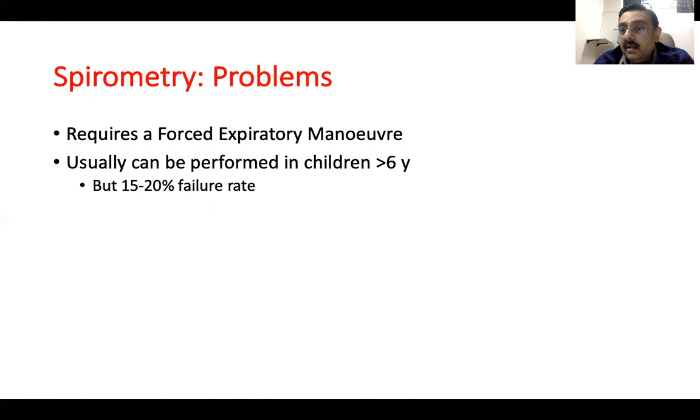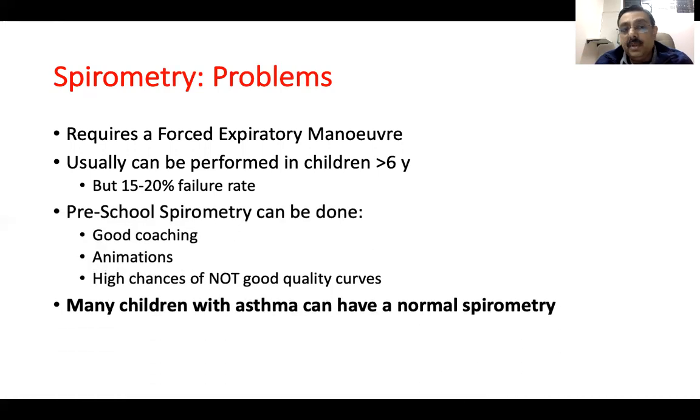Now, there are situations when you can do a spirometry even in preschool children. So there is data available. You can do that, but it requires a lot of coaching. We can use animations to help us, but still the chances of having good quality curves are not very high, right? And we also need to remember that there's a group of patients where they have asthma, but the spirometries are normal, right?